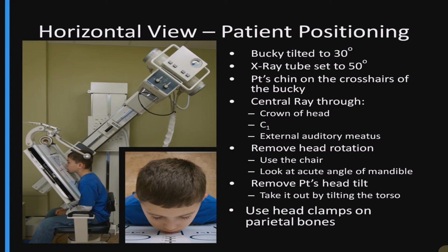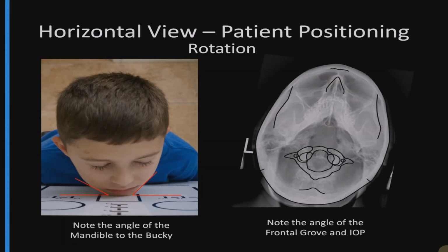We're also going to be removing the patient's head tilt, not by pushing on their head, but by tilting them at their torso. We will then put head clamps over the parietal bones.